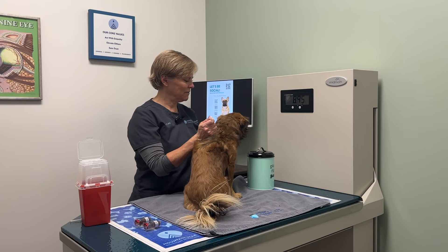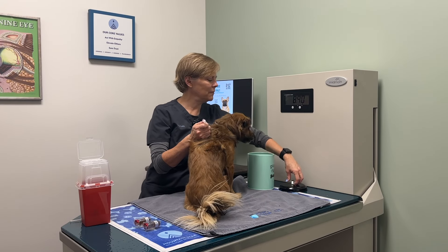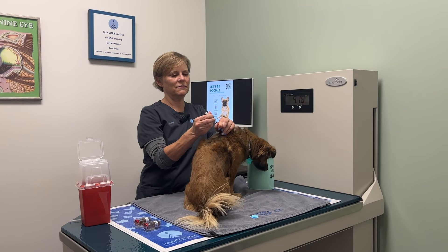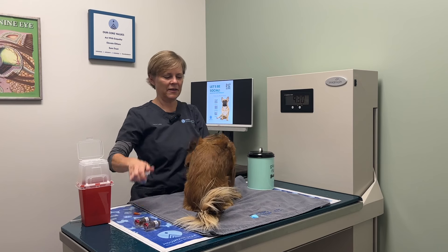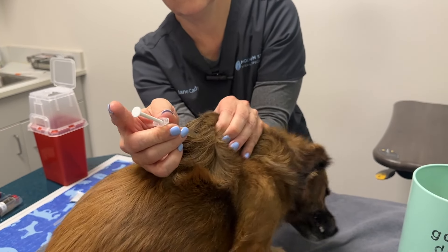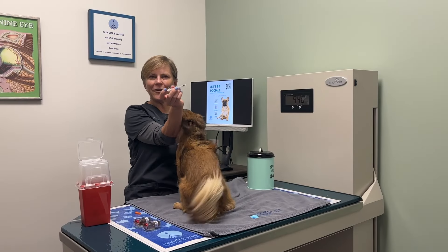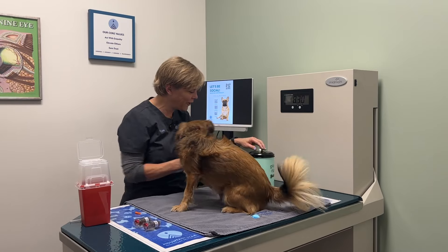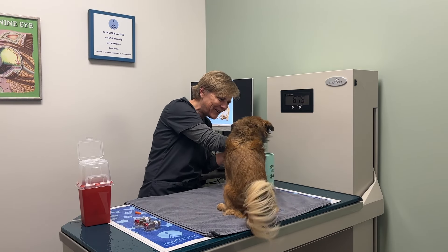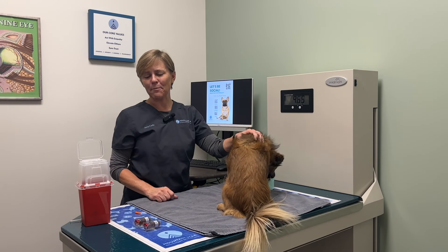Now I'm ready to give the injection. I have the cookies — give her one right now. Uncap the syringe, make the tent, put it right in the door of the tent, and depress the plunger. Good girl! Then straight into the sharps container. You did such a good job! Straight into the sharps container without putting the cap back on.